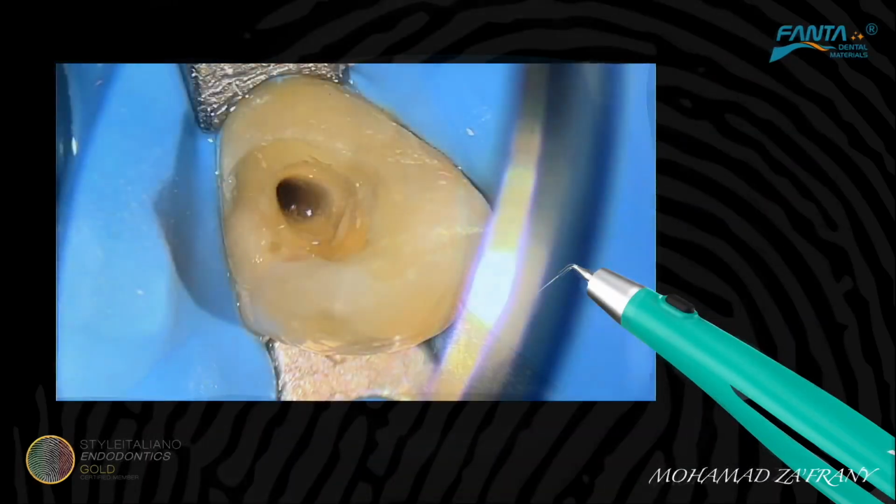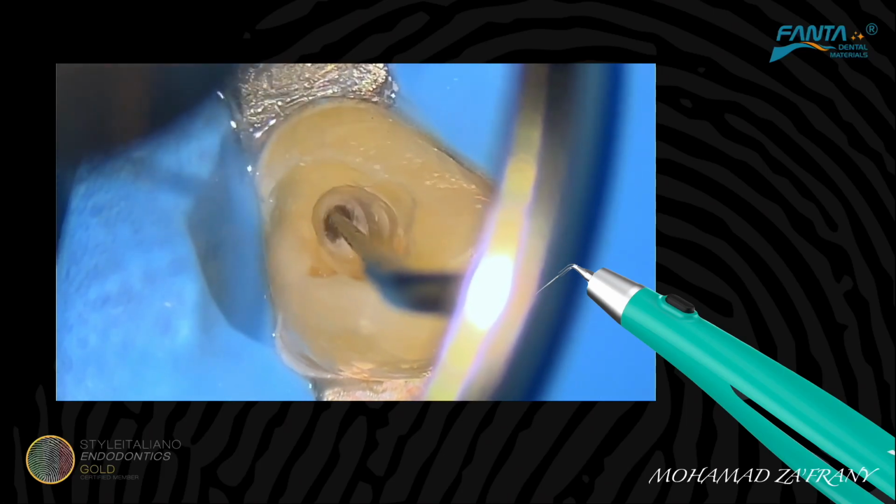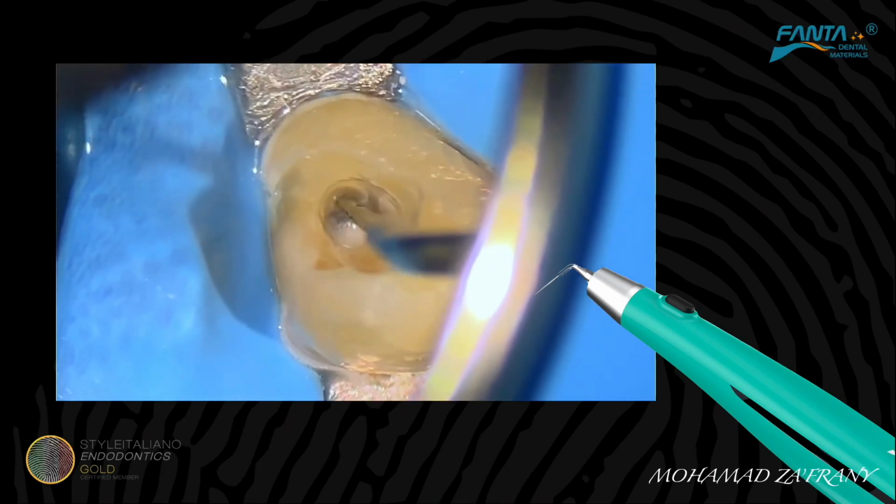In another case of retreatment, ultrasonic activation would help in the removal of all the filling material from inside the root canal system.